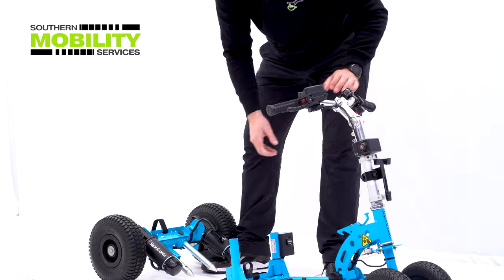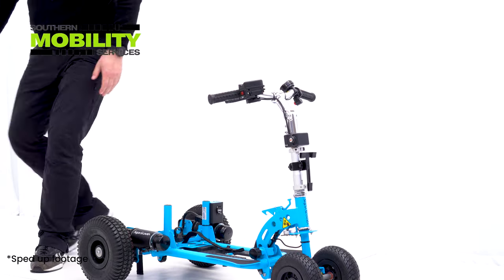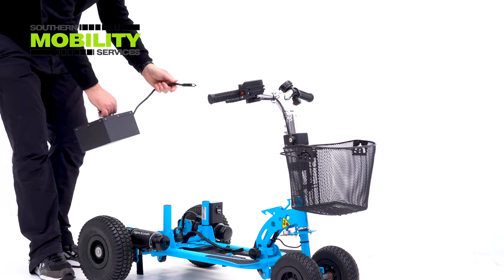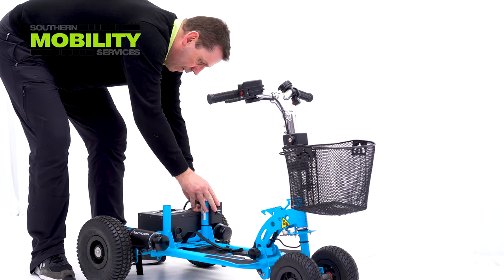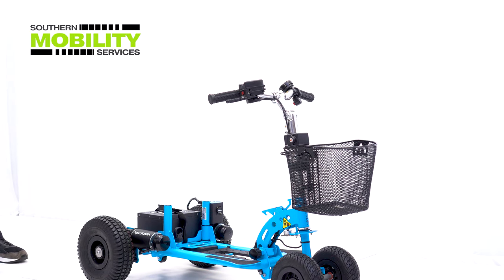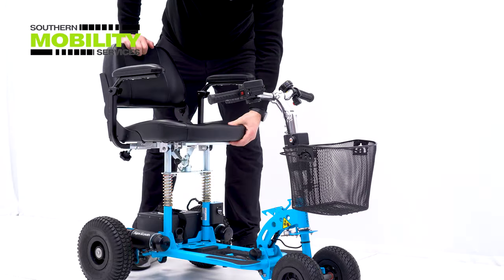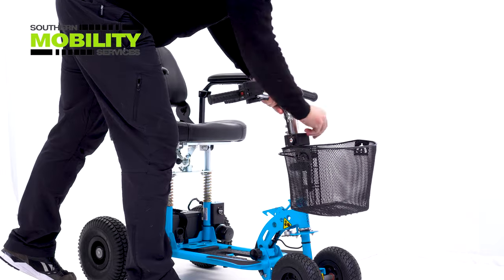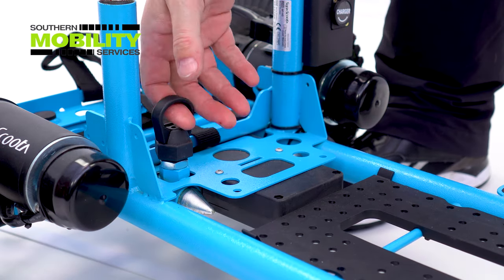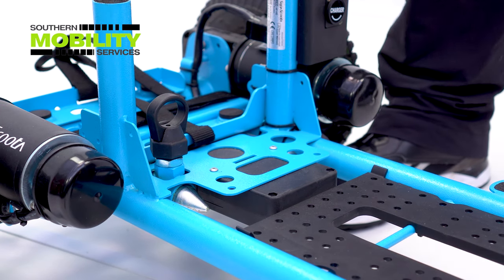It all goes back together again in reverse order. Here we're showing you how easy it is to separate the front from the back.